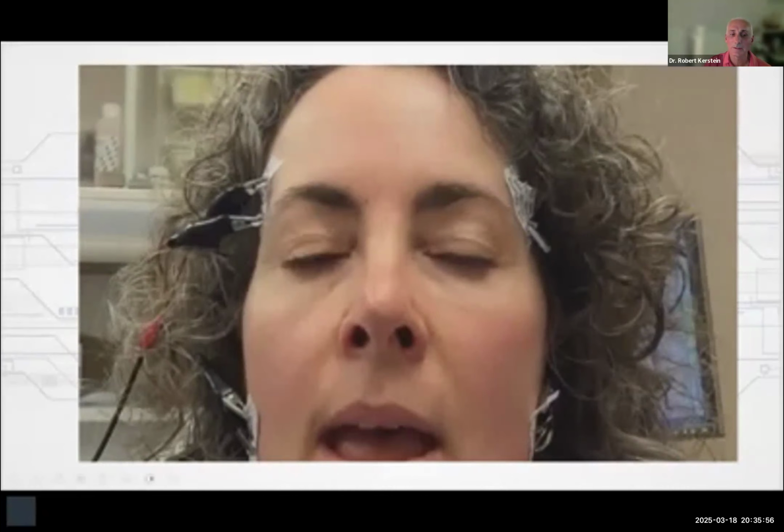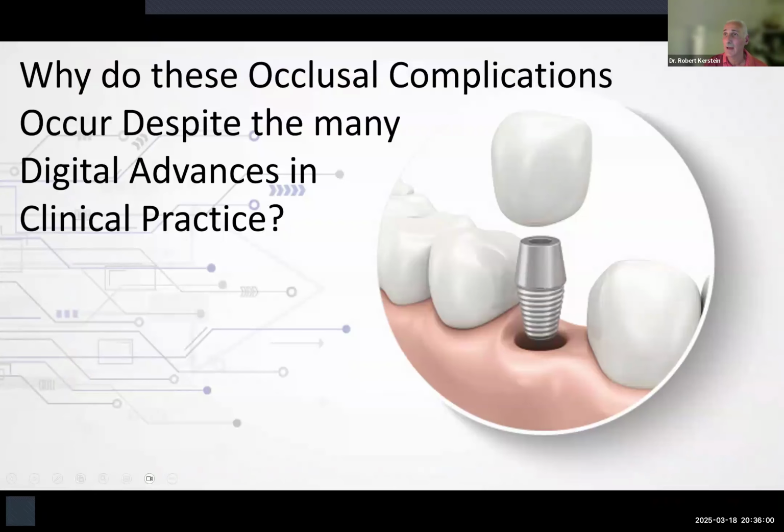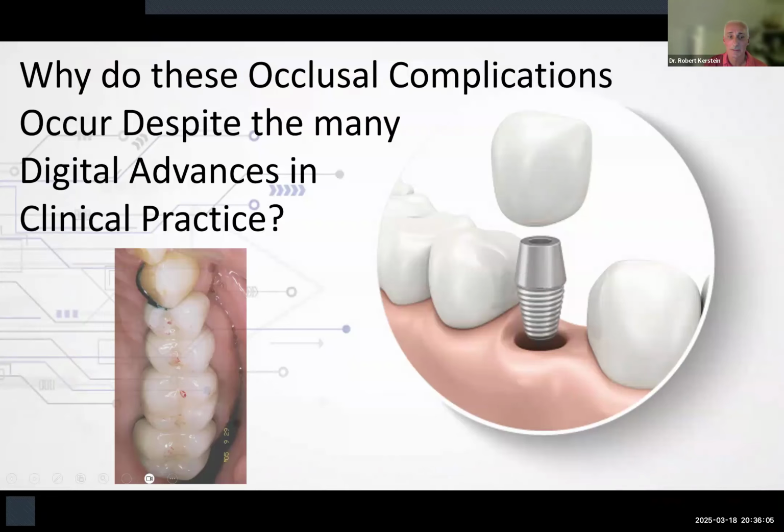Those kinds of complications are so common. They could happen to any one of us because of this material, not the porcelain, the paper, right? This is why there are so many complications, because the paper doesn't measure what we need it to measure, and what you've been taught about it actually, as you're going to find out in the next few minutes, isn't true at all.